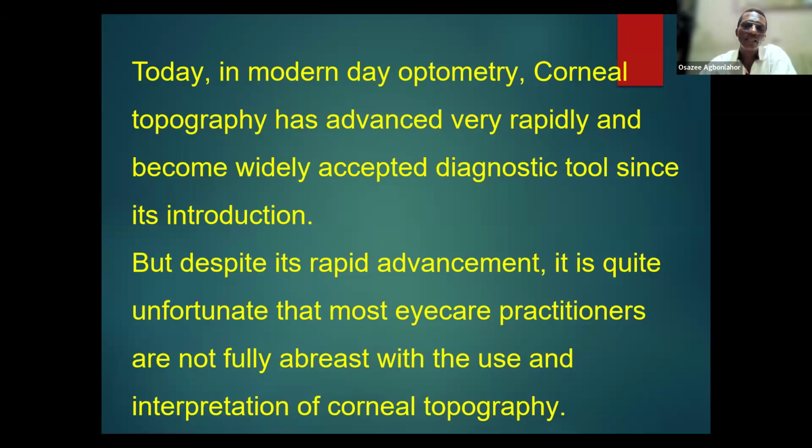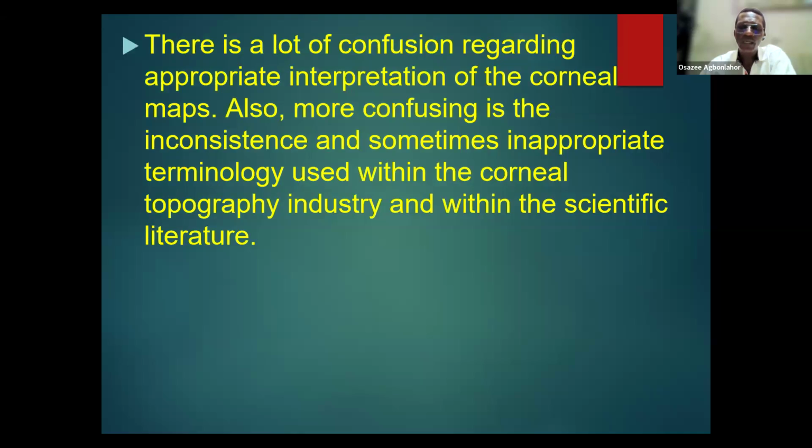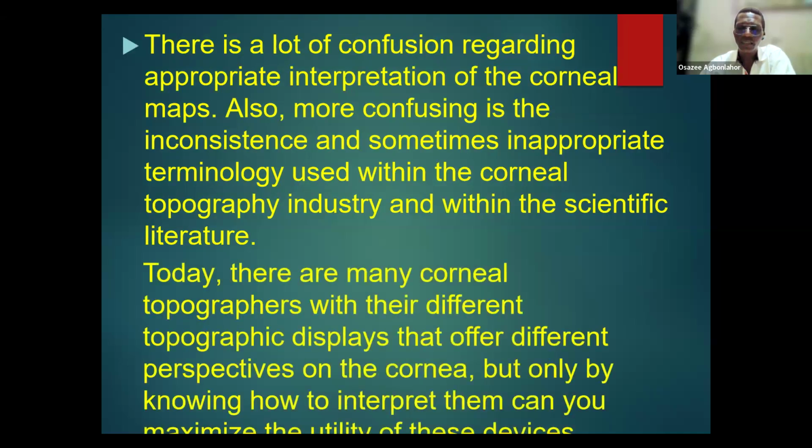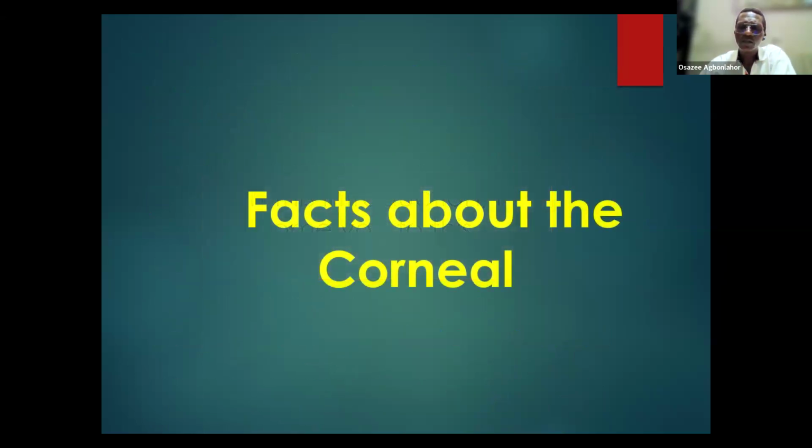find other means for diagnosing corneal ectasias, maybe with the use of slit lamp and other forms of techniques. However, this is one of those techniques that is very important as far as diagnosing corneal diseases, particularly corneal shape changes. And so it will be very important that we know this technique. So that's just a quick way to introduce you to this module.